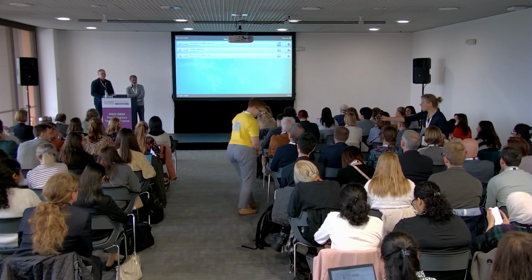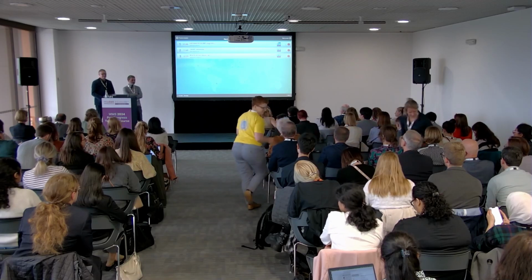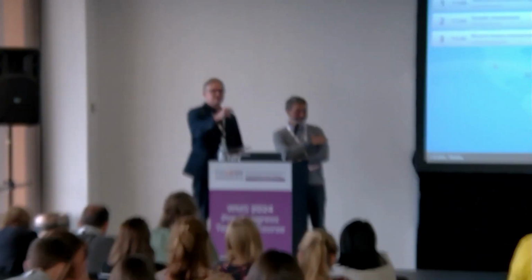Well, I think one of the important things is that the changes in the tissue that you can detect with MRI happen earlier than the changes that you see in muscle function tests. This is what has been shown in patients with muscular dystrophy, and in patients with Pompe disease, for example. So that's very interesting, because you can see a patient, repeat the muscle function test that can give you the same information, but there are already changes that are happening behind the scenes in the muscles that you can detect with the muscle MRI. So for me, it's not a fight here.